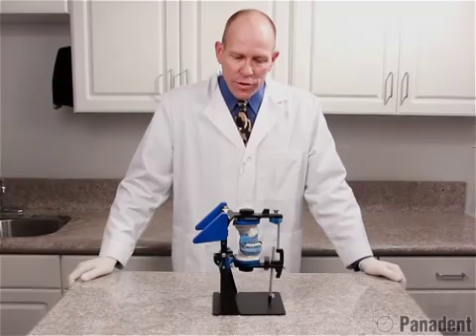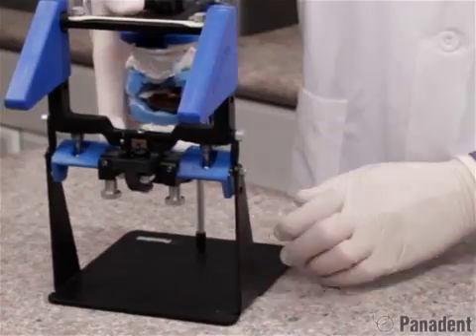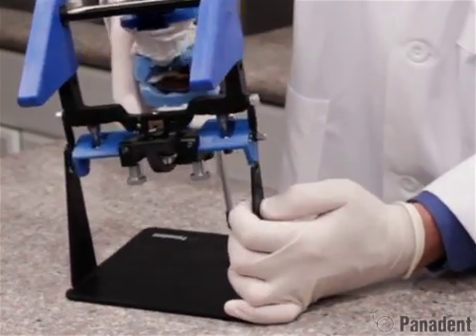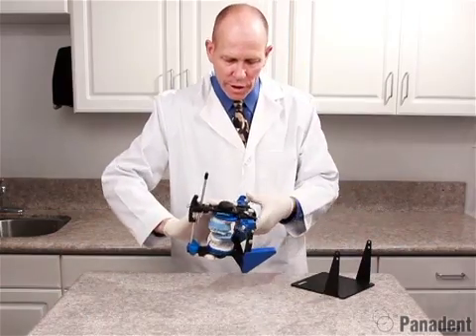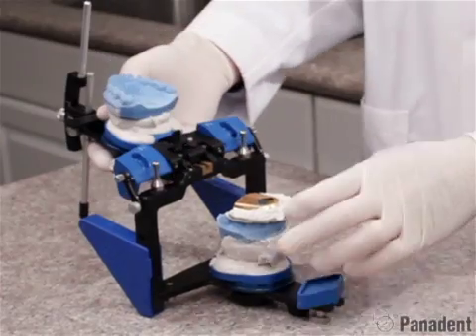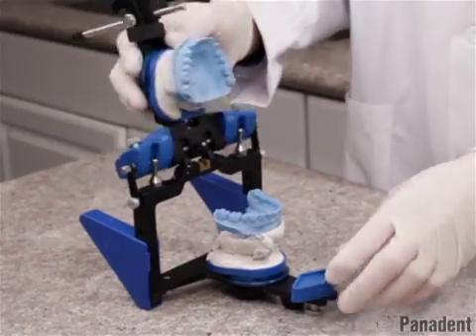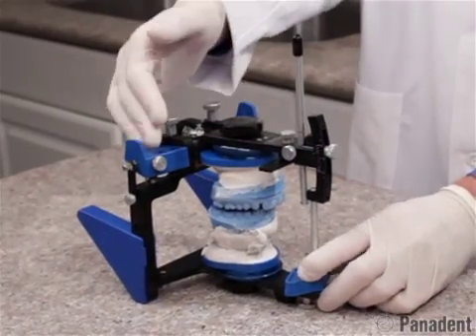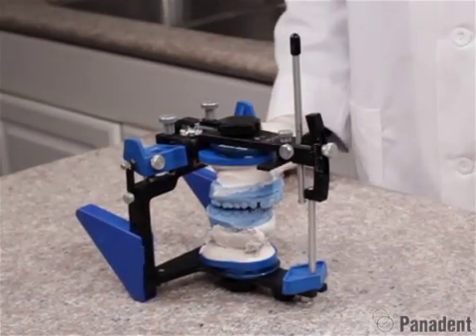The plaster is now set so we can go ahead and remove the articulator from the mandibular mounting stand by springing one side out over the Dynalink pin and removing the articulator and setting it right side up on the countertop. We can then open the articulator up to remove the centric relation record. And we can now adjust the protrusive angulation using the protrusive check bite at this time.